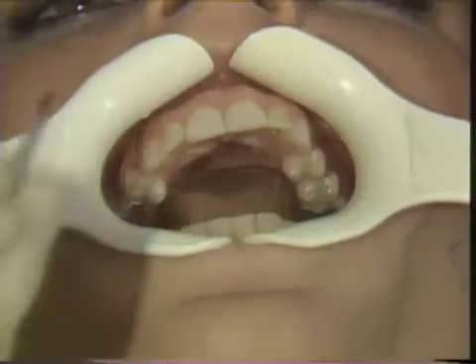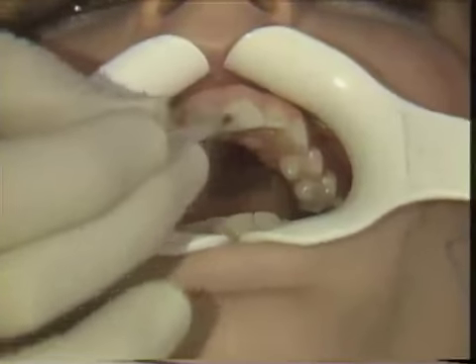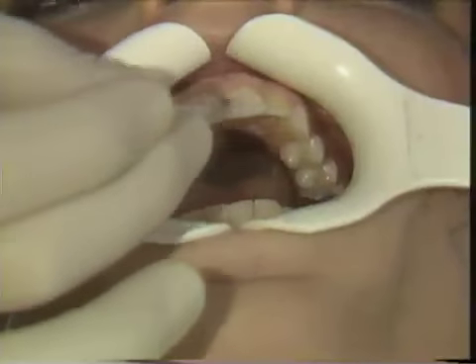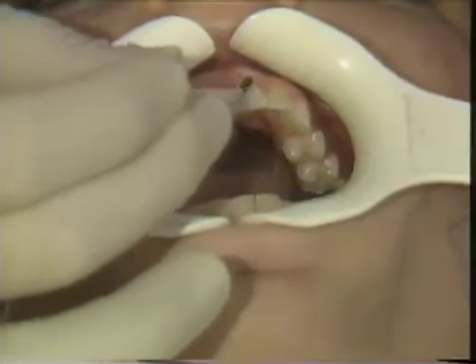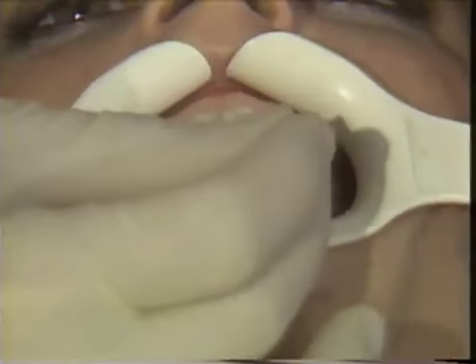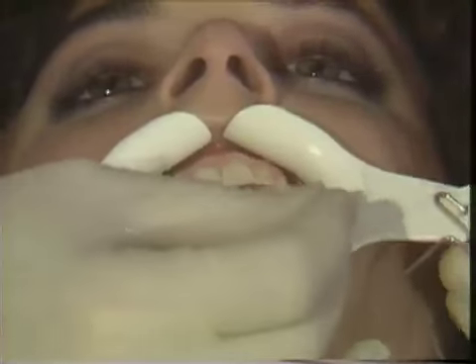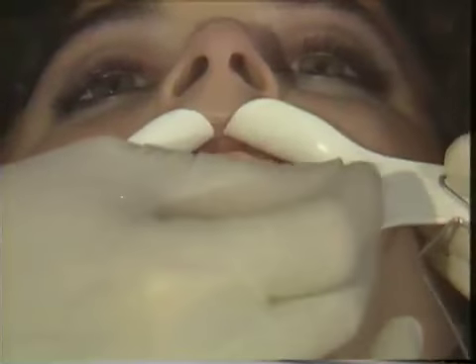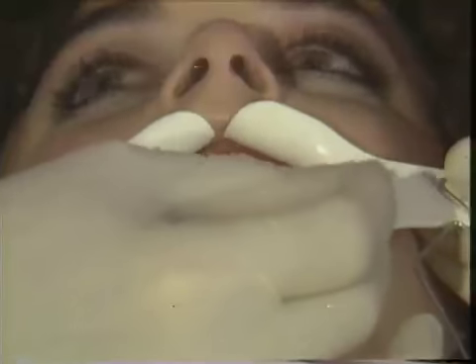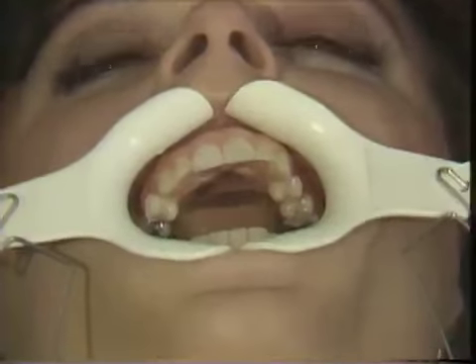The catalyst is in the Reliance primer. That's the liquid that is being applied to the enamel surface, and it should be applied in a very, very thin layer. This same primer will also be applied to the bracket base in a thin layer. And then, of course, the bonding paste would then be applied to the bracket, and the bracket applied to the tooth.